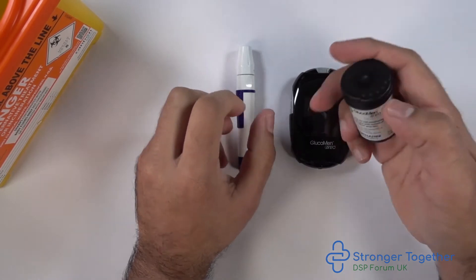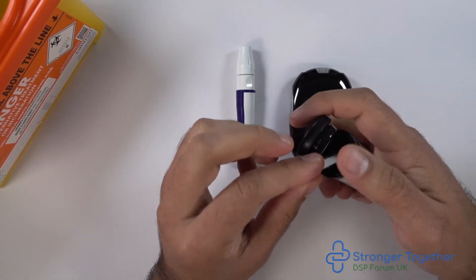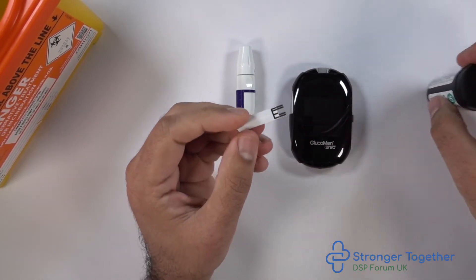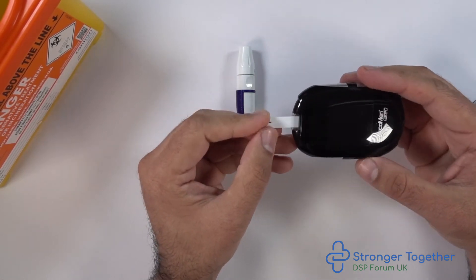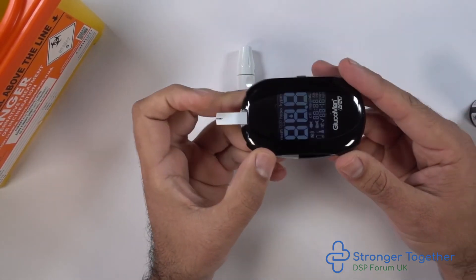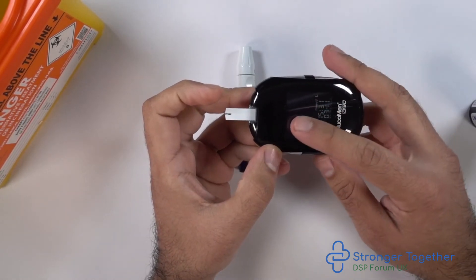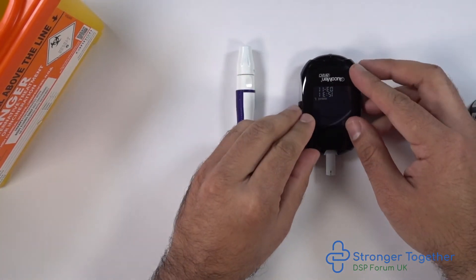We then take our test strip with the white side facing upwards and the section of the test strip with the black markings in the direction of the test strip slot on the meter. When we insert the test strip into the meter it switches on and you can see there is a blood drop flashing on the screen. This means it is awaiting your blood sample.